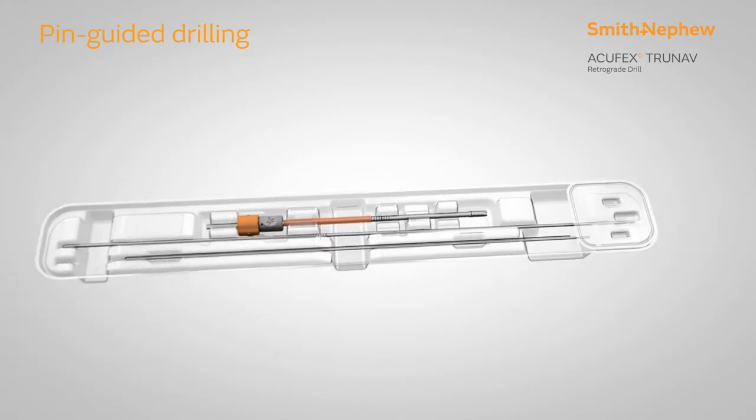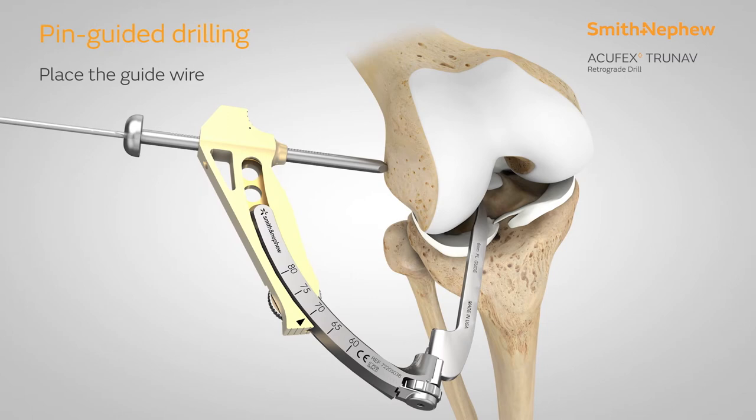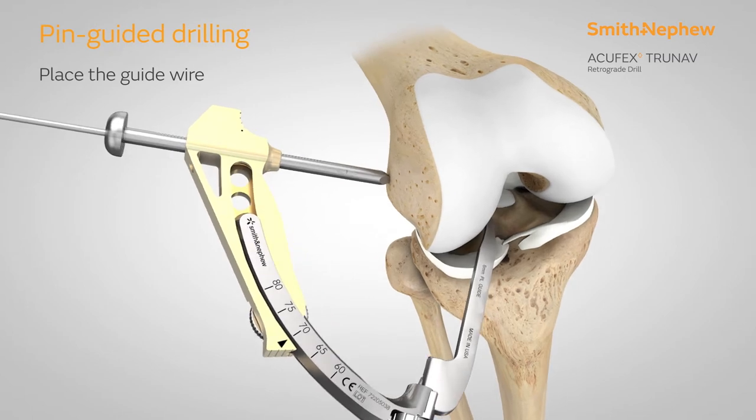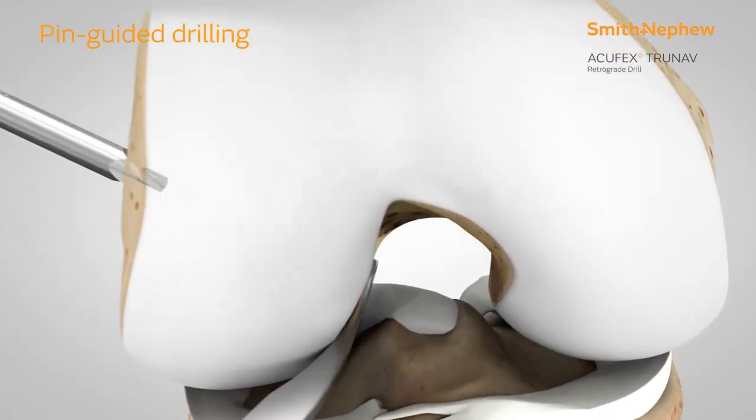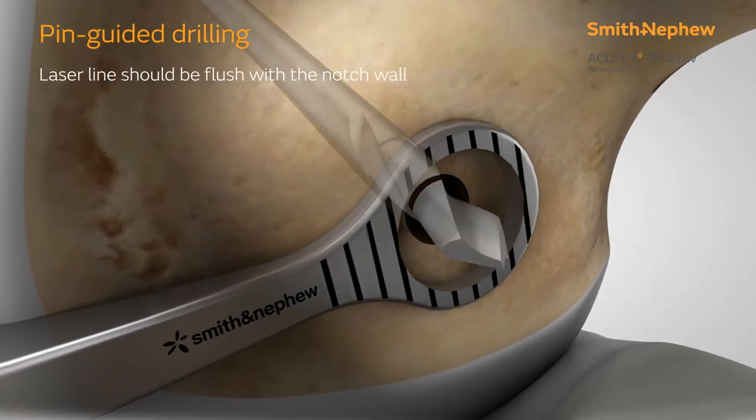Select the guide wire from the correspondingly sized Acufex TrueNav Retrograde Drill Kit. Using the Acufex Pinpoint Pivoting Guide System, place the guide wire in the desired location. Drill until the laser line on the tip of the guide wire is flush with the notch wall.